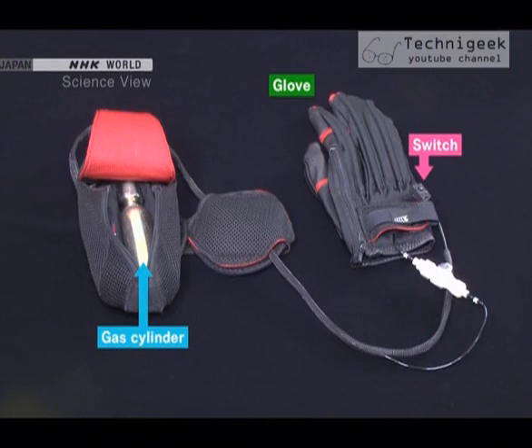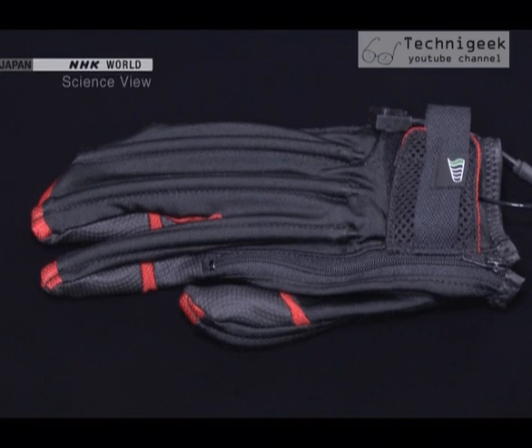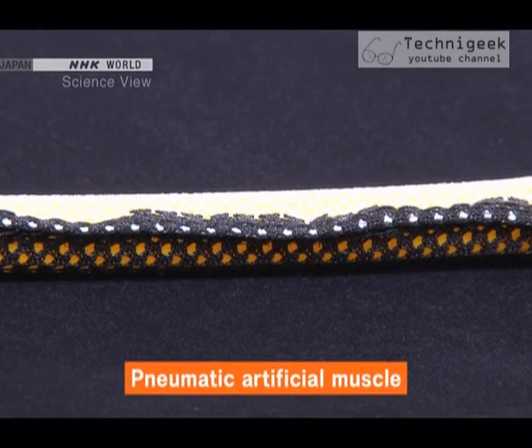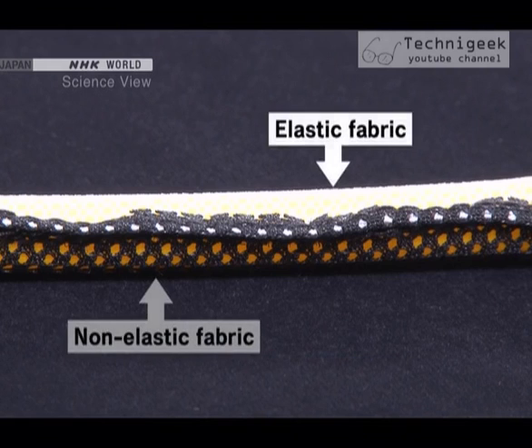Let's find out how it works. It consists of a glove, a switch, and a gas cylinder. The glove has a built-in pneumatic artificial muscle. This pneumatic artificial muscle is made with a rubber tube and covered with fabric. The upper half of the fabric is elastic and the lower half is non-elastic.